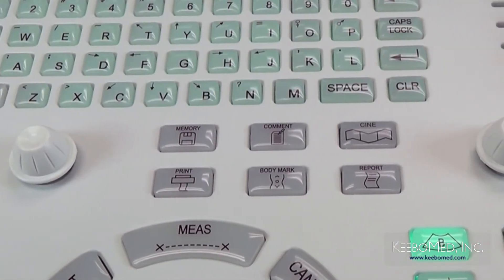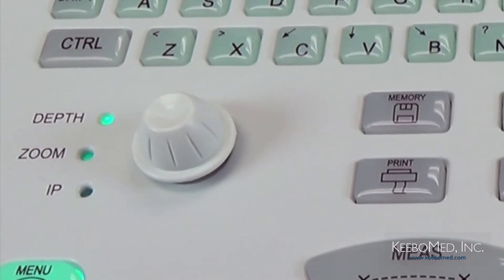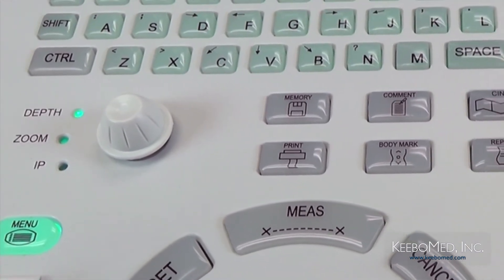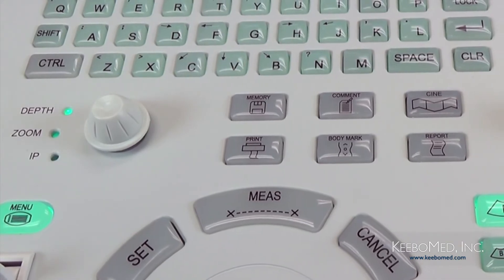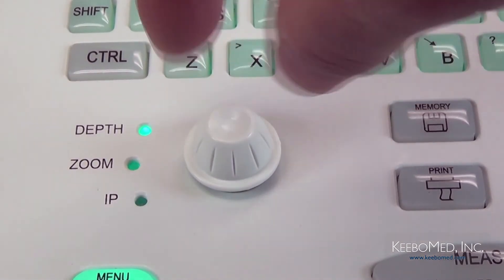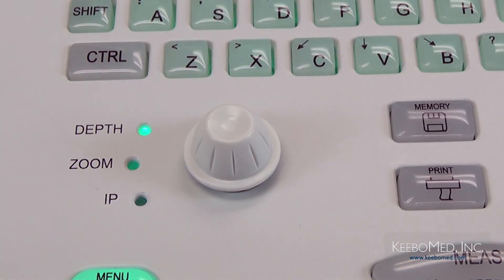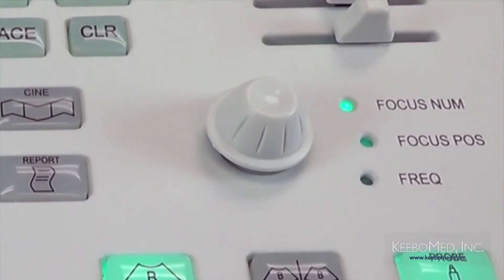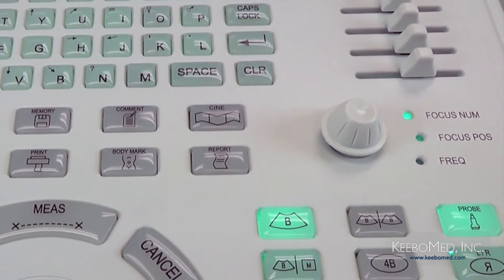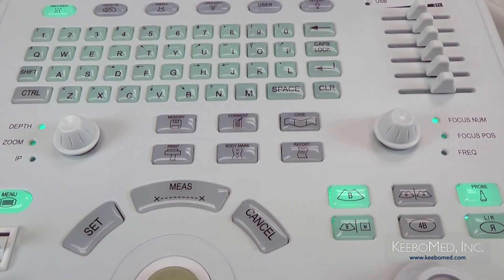On each side of the group of six keys there are two multi-function knobs. On the left are the depth, zoom, and IP settings. Pressing down on the knob allows selecting each function, and the green light will indicate which setting can be adjusted. To make adjustments, simply rotate the control knob. On the right side, the knob has focus number, focus position, and frequency settings, adjusted using the same procedure.